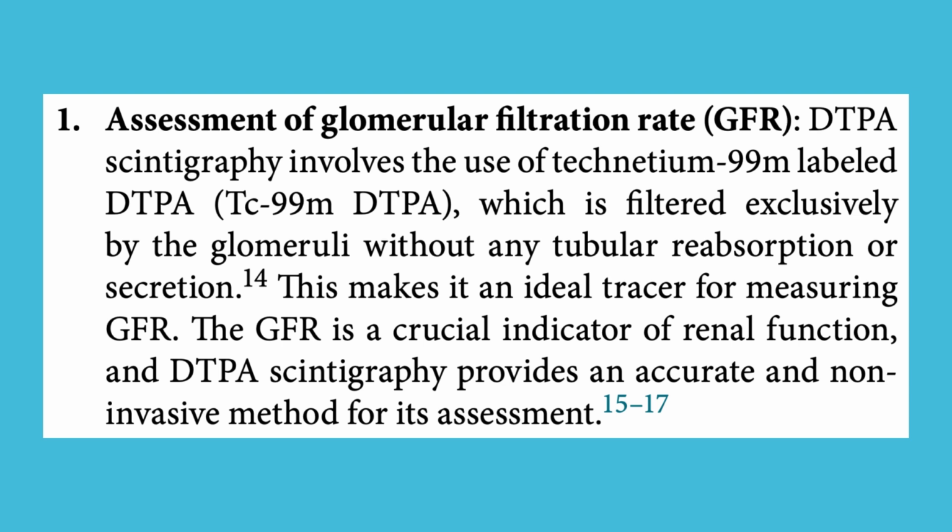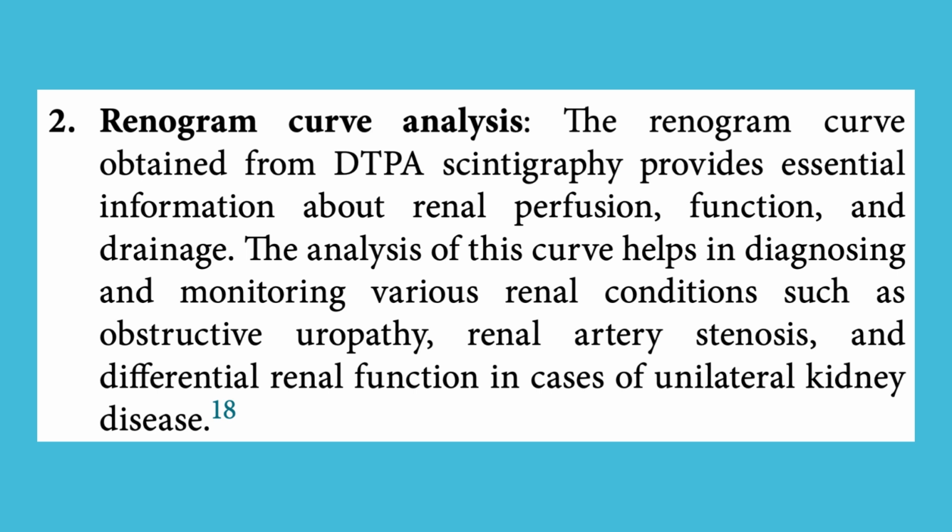which is filtered exclusively by the glomeruli without any tubular reabsorption or secretion. This makes it an ideal tracer for measuring GFR. The GFR is a crucial indicator of renal function, and DTPA scintigraphy provides an accurate and non-invasive method for its assessment. 2. Renogram curve analysis.